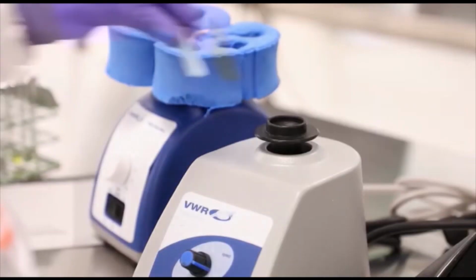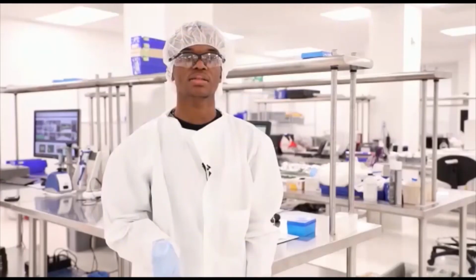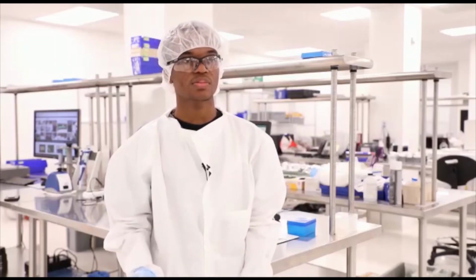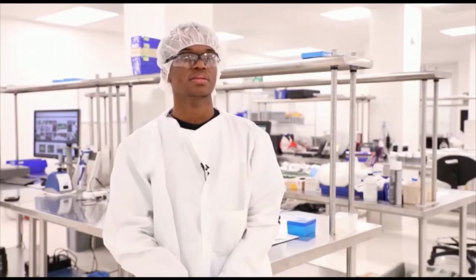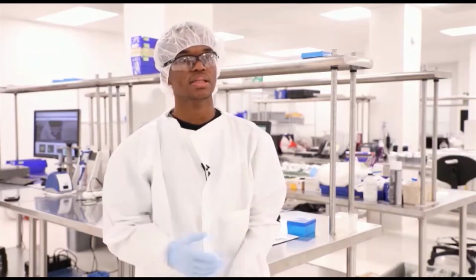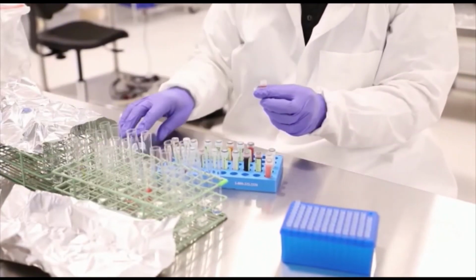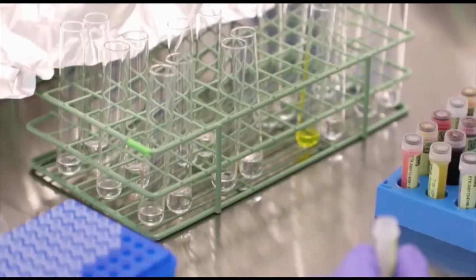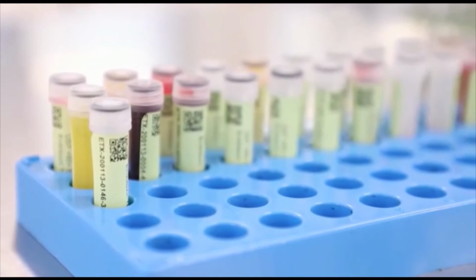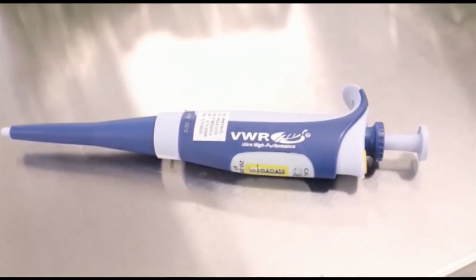Sterilization is not the same as endotoxin free. Even though a sample might be sterile, it does not mean that it's endotoxin free. And because of the potential effects on human and animal health, you want to make sure that your product is endotoxin free as well. Per USP, all category 2 injectables, that is compounded sterile preparations, and also those assigned with the BUD, or sterility testing as well, have to be tested for endotoxin.